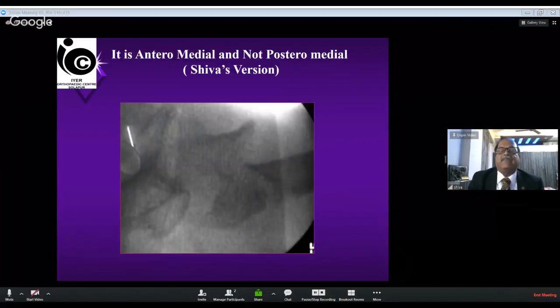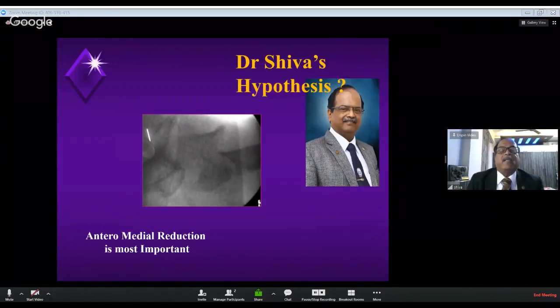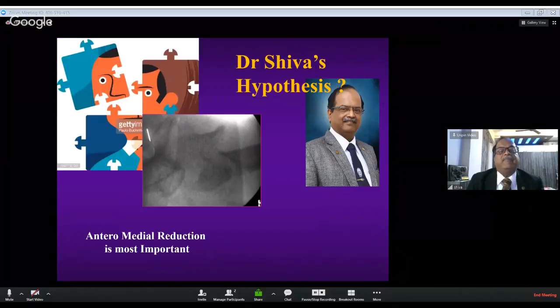Here is an X-ray of the lateral view of a hip. You can see the anterior cortex, but the comminuted posterior cortex, which is more osteoporotic, we can hardly see. So there is no point in talking about posterior comminution in these fractures, which we cannot see on our X-ray or CT picture. So it's better to reduce anteriorly, and automatically when the anterior reduction happens, the posterior one also gets reduced. So the anterior cortex is like the medial tibial condyle, where it splits because the bone is thick and strong, it splits.